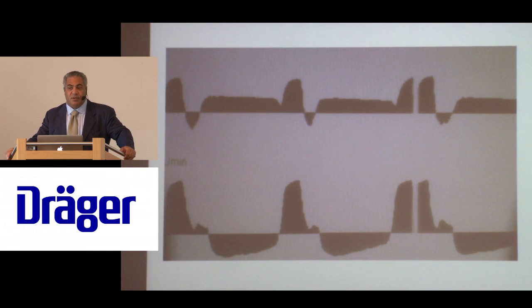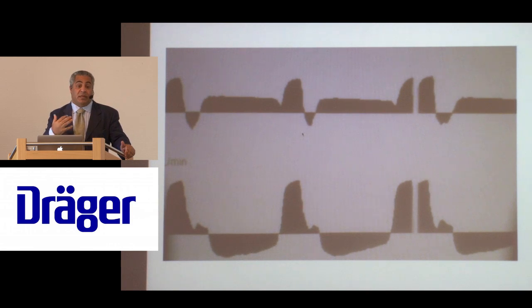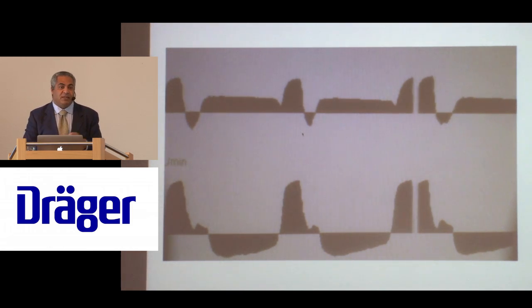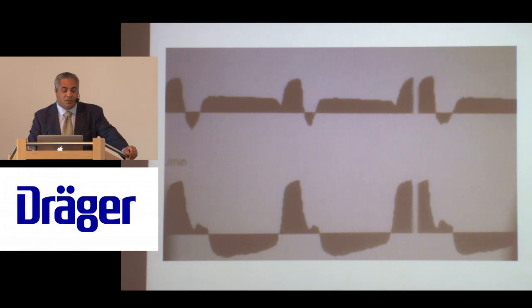And here's another patient. This is a patient on low tidal volume strategy with autoflow or PRVC, which is actually algorithmically going to allow the patient to get more air. And so what happened was the physician wanted a certain tidal volume to do low tidal volume, but the patient wanted twice that much. So they were moving more air, lowering the pressure. So in order for them not to have this tidal volume that was 800 cc's instead of 400 cc's, they switched to volume ventilation. And now you're able to see what's going on in volume ventilation.